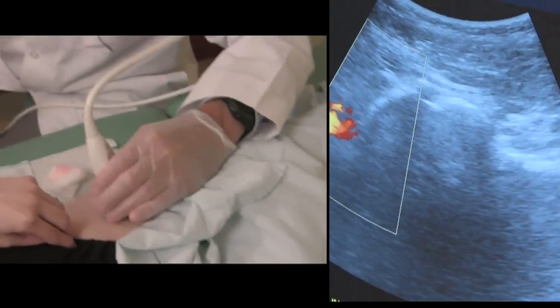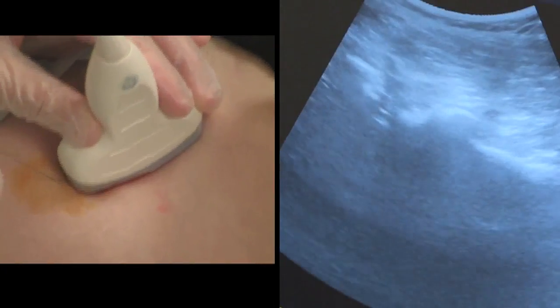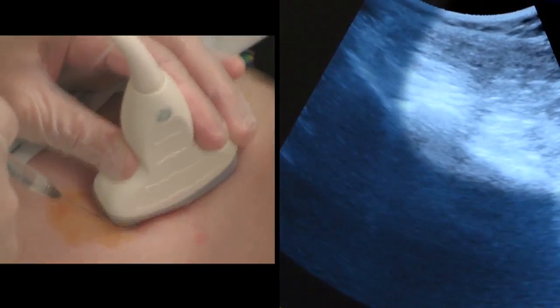Ultrasound is very safe in guiding needles to the exact area where the solution is needed. In this image you can see the hip joint and the capsule where you will see a needle being placed and depositing solution.